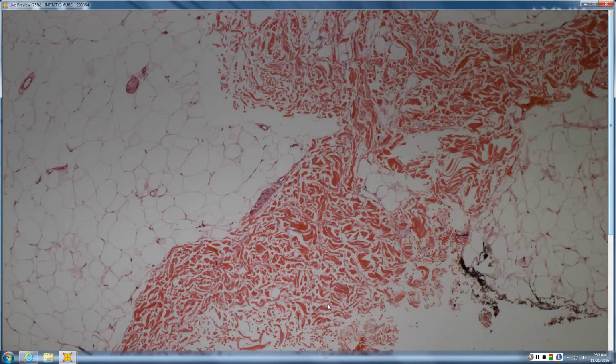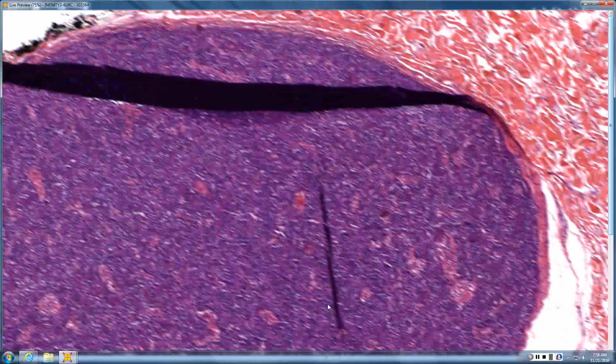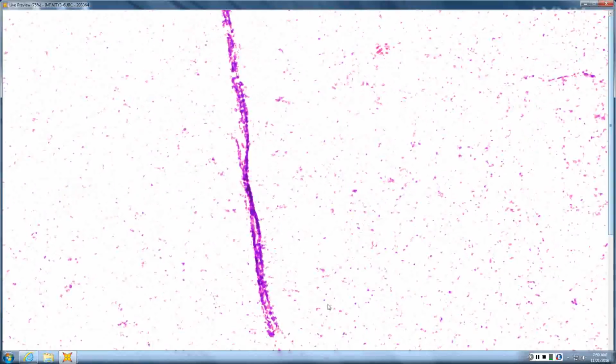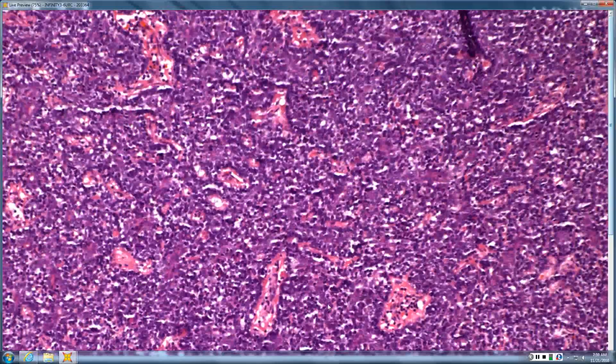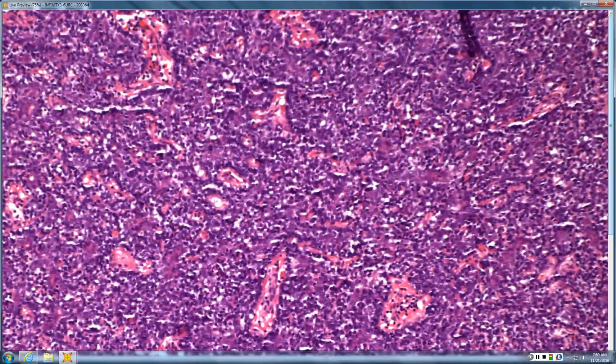So we are doing our review of the exam, and so Shane, you want to jump in and see what you thought? A blue ball in the dermis, composed of paler gray, darker gray cells to the periphery, and then peppered with jet black lymphocytes. You are correct.